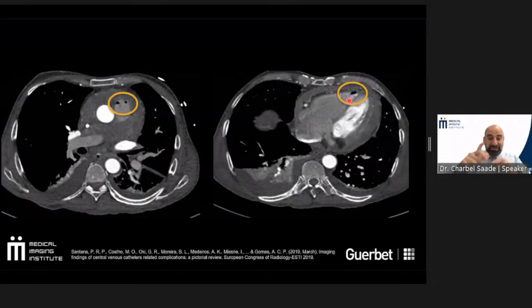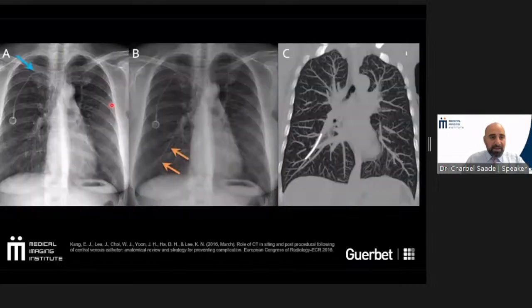You know, don't tap on the syringe because you'll start affecting the plate of the motor. You pull back and pull forward in order to reduce those bubbles and wash those lines with saline. That's why I always recommend using 100 mL saline, filling it up, clearing all the bubbles out, because any bubbles that go into this area can cause imaging artifacts. And interestingly, 23% of all injections have air in the pulmonary system because of air in the extension tube and in the syringes.